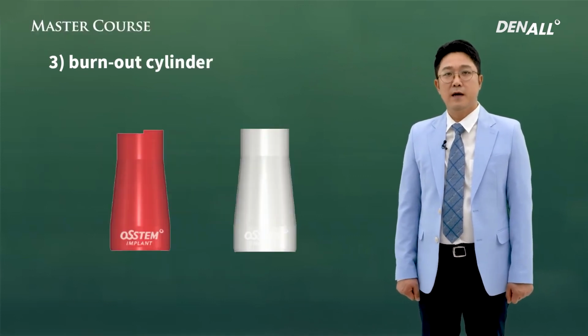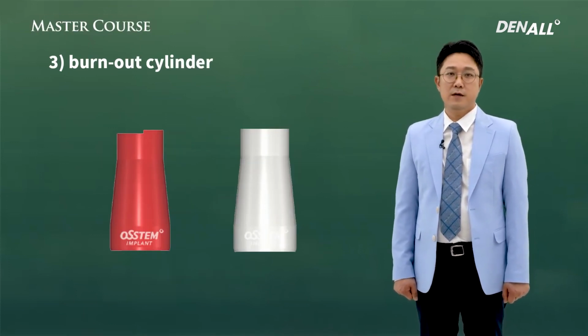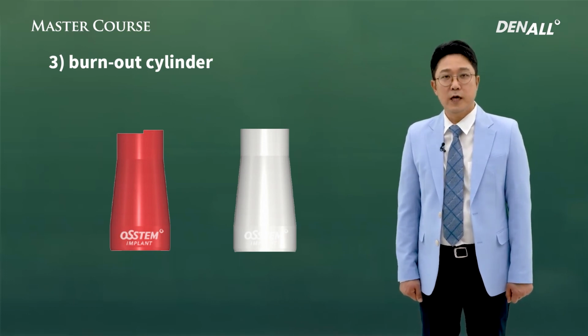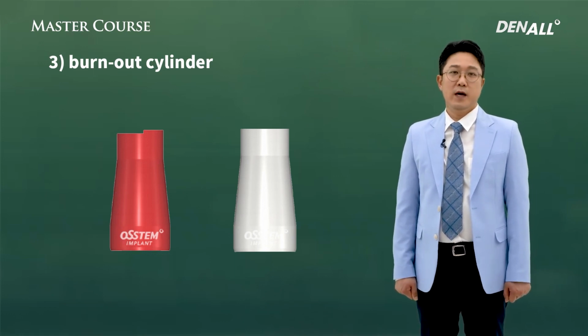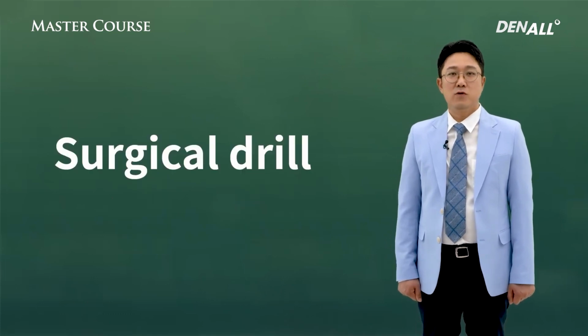Next is burnout cylinder. This is similar to wax up for crown fabrication. It is connected with lab analog for wax up, and this is used at lab, so this may sound a bit foreign to you. Finally, I would like to talk about surgical drill.